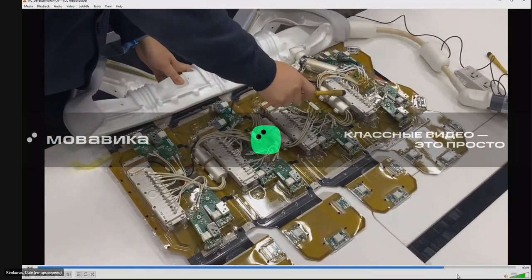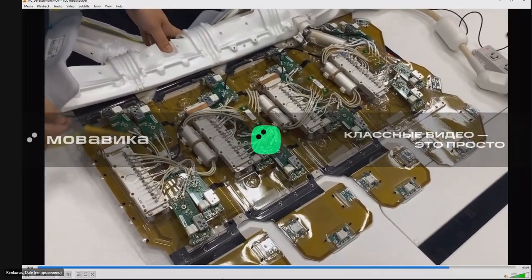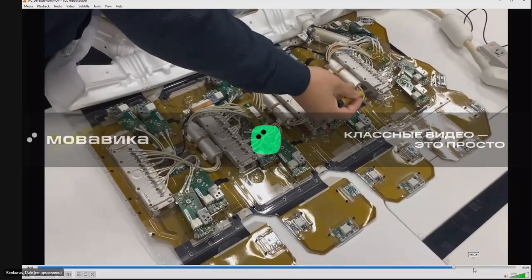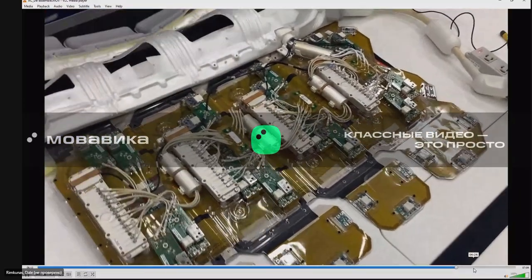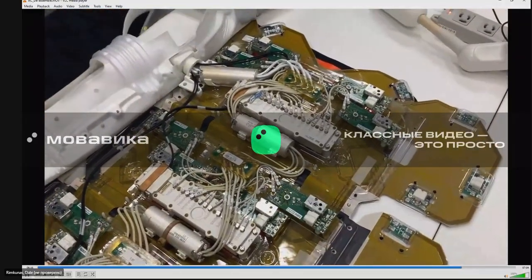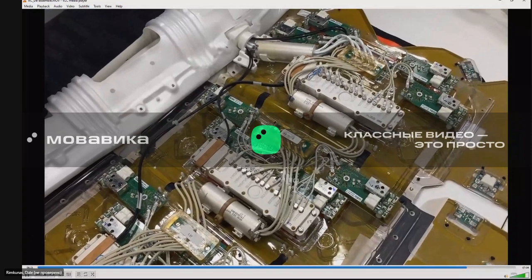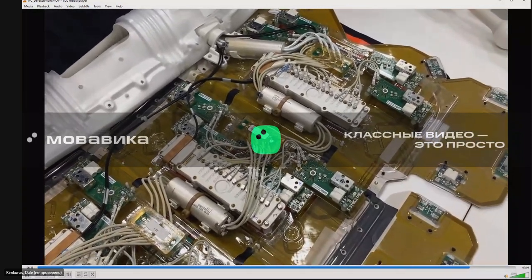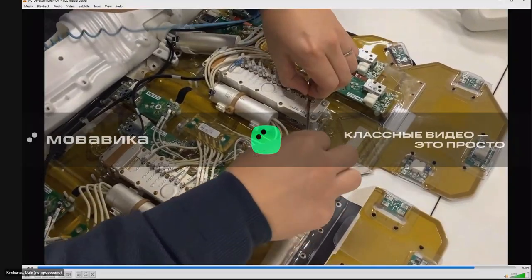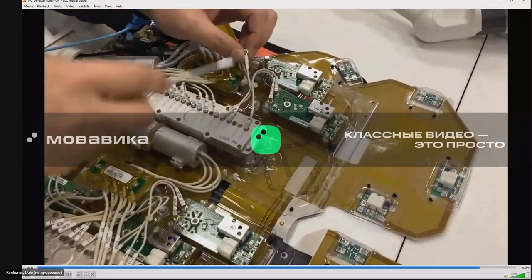RXC M0, M1, M2, M3. So now you have access to each connector. You can actually disconnect it and reconnect it, and it's very simple. They are not soldered into place. There are cables that can be removed, inspected and reseated on the RX M0 R4. Just go ahead and take this out, just like this, and check.